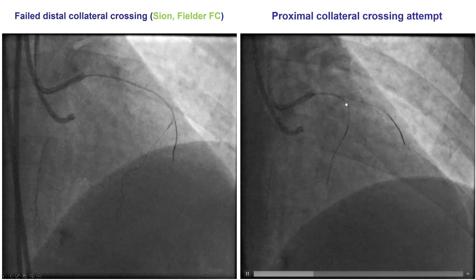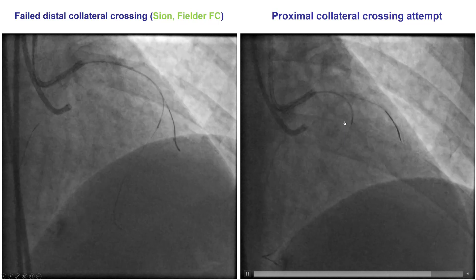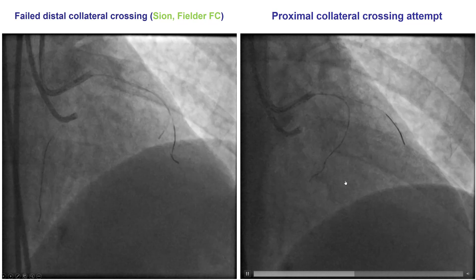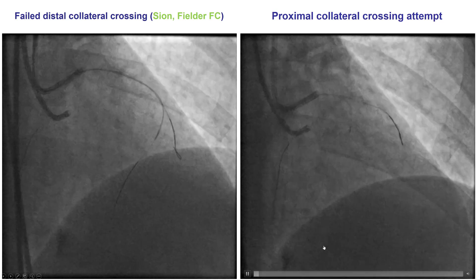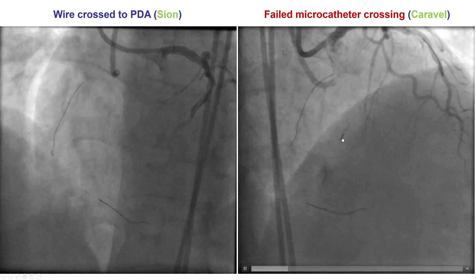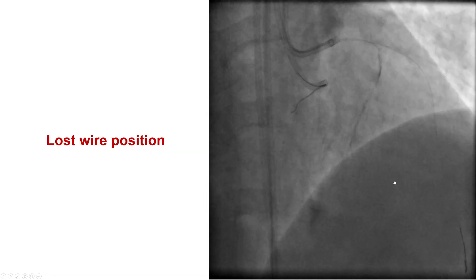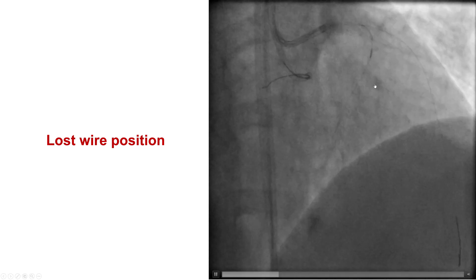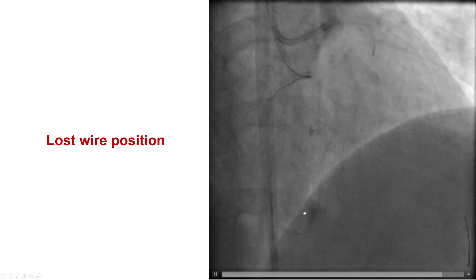We then used a twin-pass microcatheter, and by doing that — specifically a Supercross 120 angulated microcatheter — we were able to advance a wire into the septal. We then advanced a Caravel microcatheter and through this we advanced a Sion wire, which actually did cross through a collateral all the way into the distal RCA and then going antegrade into the right posterior descending artery. This was confirmed by injection from the left. However, we could not advance the Caravel through the collateral all the way to the PDA despite it being a small profile catheter. Unfortunately, during these attempts we lost the guide wire position. We tried again using the Supercross 120 entering the first septal, but now we had a disruption of the collateral we had followed previously and were unable to reconnect.